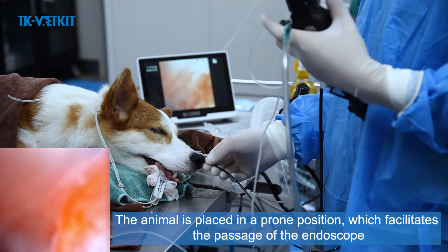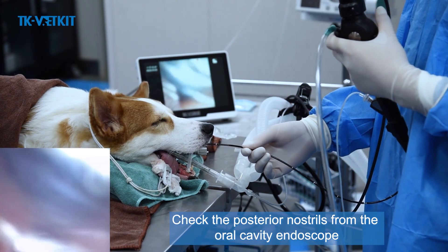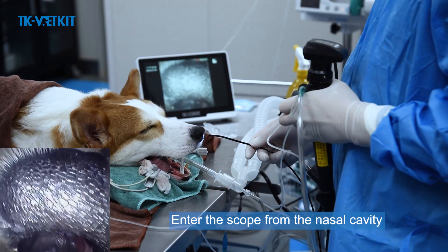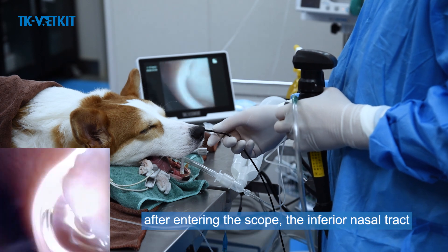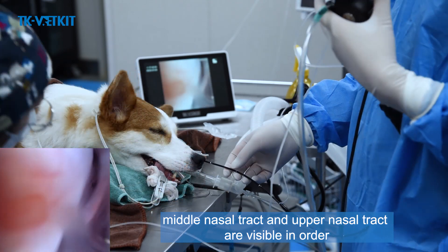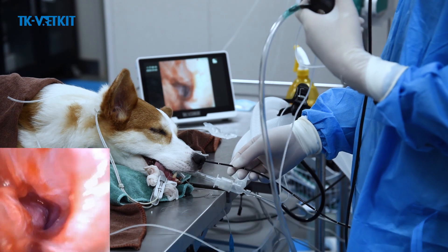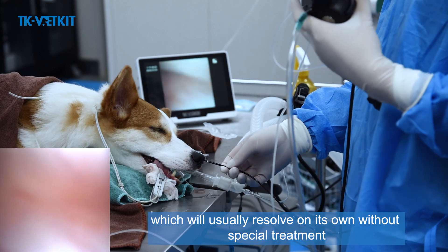The animal is placed in prone position to facilitate endoscope passage. The posterior nostrils can be checked from the oral cavity; this approach allows reverse observation and evaluation of whether there are tumors or foreign objects in the posterior nostrils. When entering from the nasal cavity, water injection is required while advancing. The inferior, middle, and upper nasal tracts are visible in order. After passing through the middle nasal tract and entering the posterior nasal cavity, masses and abnormalities can be evaluated. Nasal examination may damage the nasal mucosa and cause bleeding, which will usually resolve on its own.